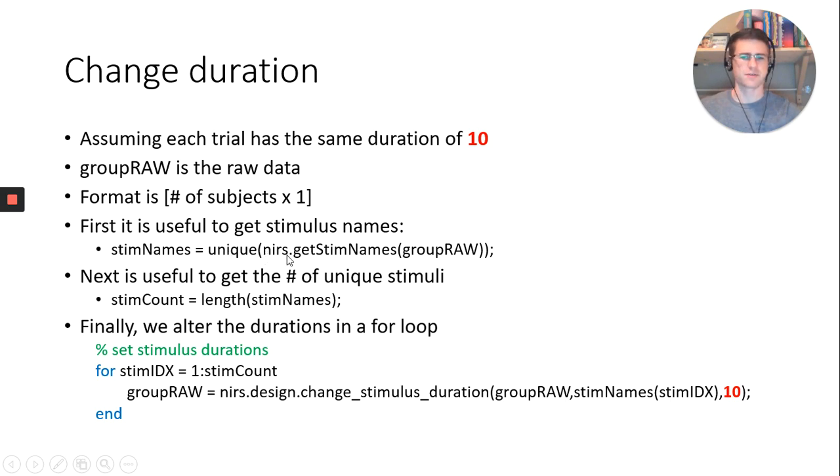I'm going to go in my NIRS folder. There's a function called getStimNames, and I'm going to call it on my raw variable. I use the MATLAB function unique, which will ignore duplicate values, so it gives me only the individual stimulus names I have. I output it as StimNames. Next, you're going to want to figure out how many different types of stimuli you have. So all you have to do is get the length of StimNames and save it as StimCount.